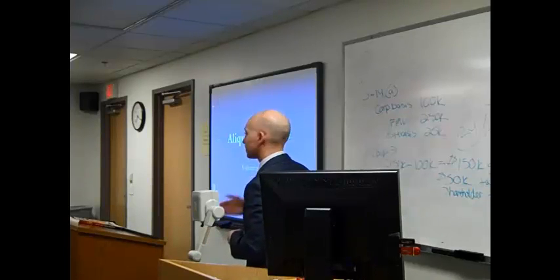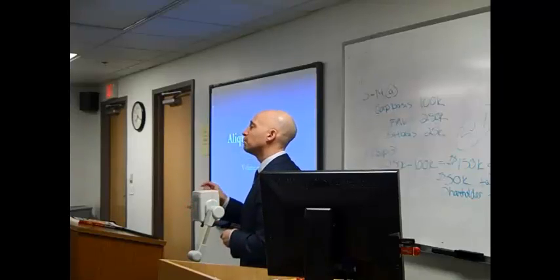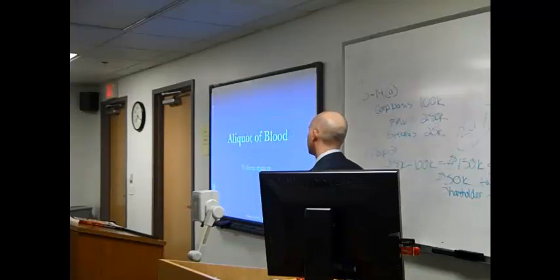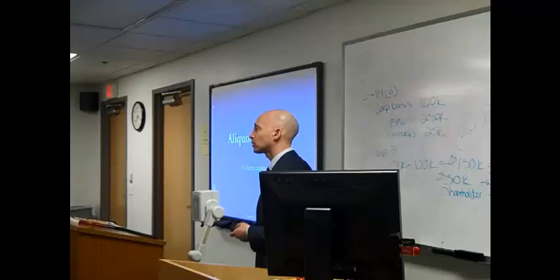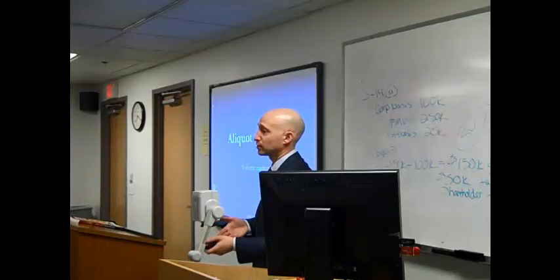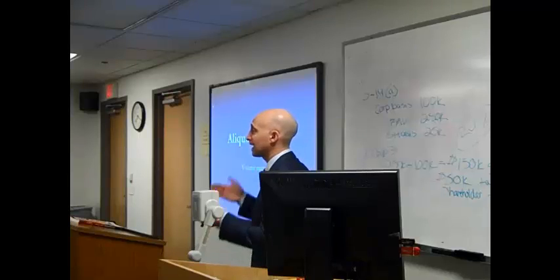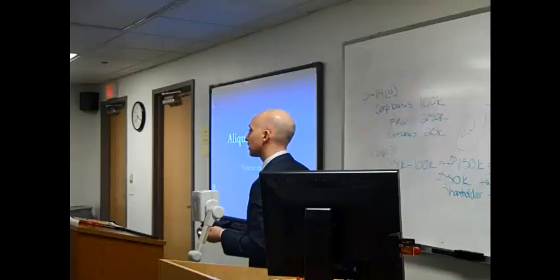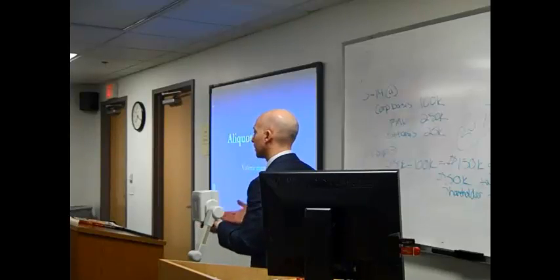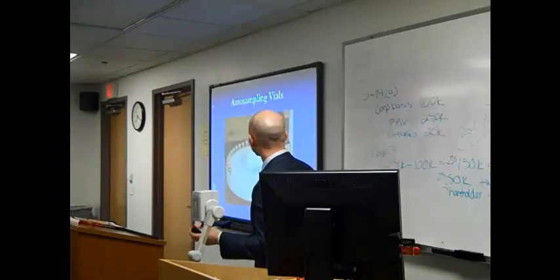Volume. So, as I mentioned to you before, you're usually taking 1 milliliter of blood, and it's called an aliquot. All right, so it's just a volume of blood. If you're taking more than 1 milliliter, you're ruining the entire process. If you're taking less than 1 milliliter, you're ruining the entire process. It has to be precise, 1 milliliter. And the same for the internal standard. There has to be a particular amount of internal standard.